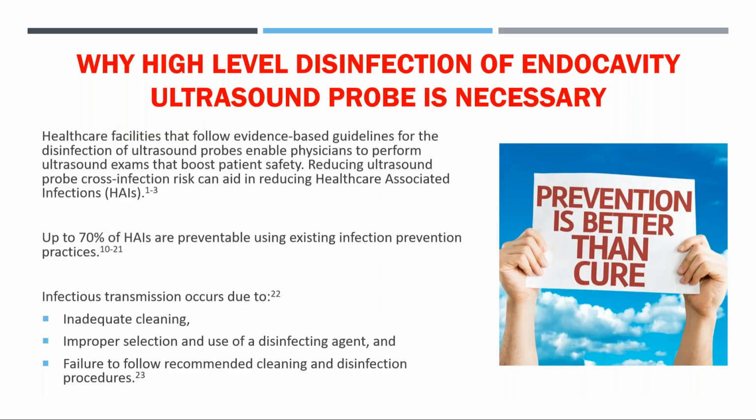So this is why disinfection of endocavity ultrasound probes is necessary. This is a general statement not specific to infection prevention, but to all diseases, in fact. Prevention is better than treatment, trying to cure a patient afterwards. I should say, by the way, prevention is always better in life, such as wearing seatbelts as another example. Always better to prevent injury than deal with the consequences afterwards.